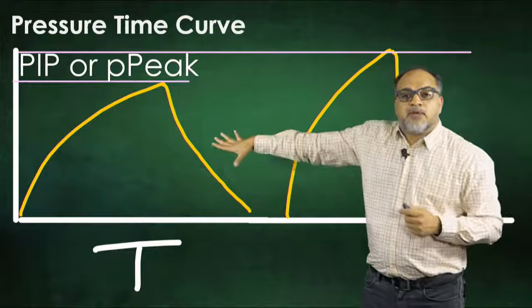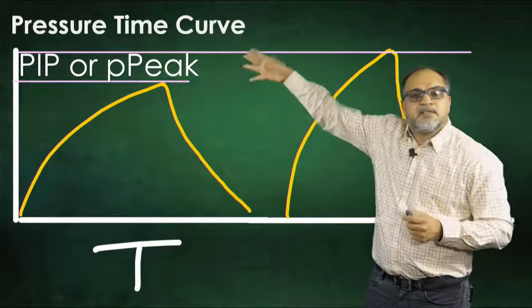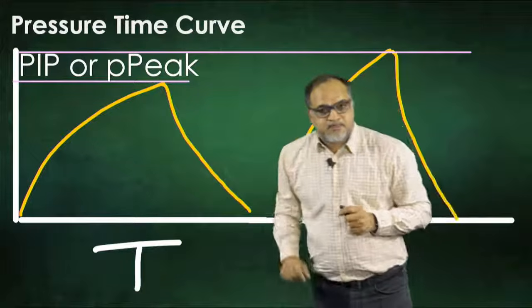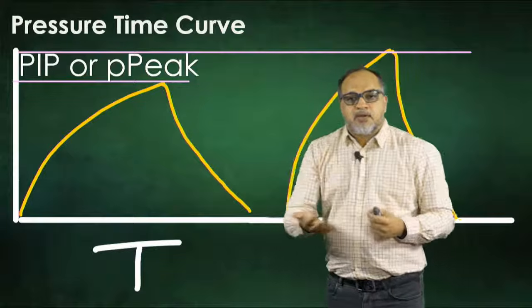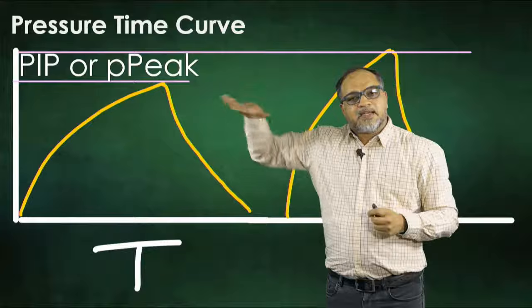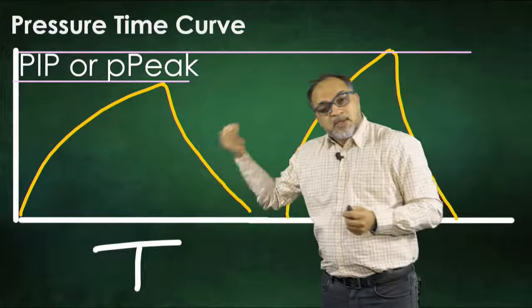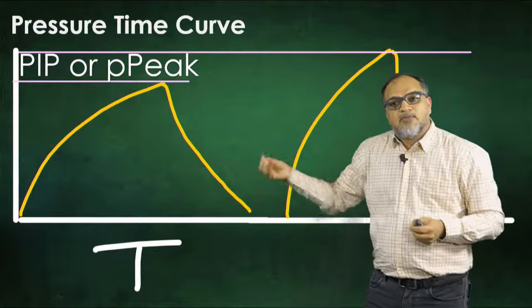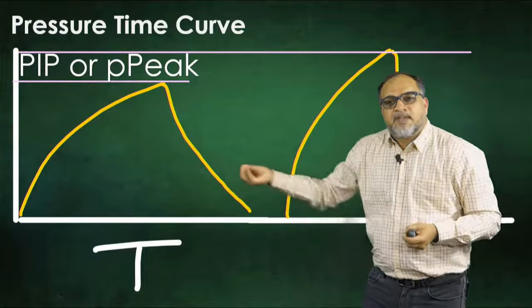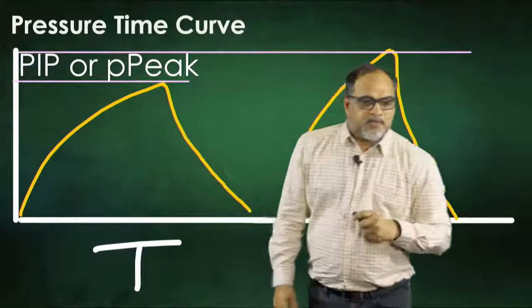This is volume control. The volume is guaranteed, but the pressure it will take to rise is not in my hands. And vice versa. If the same patient was on pressure control, I would keep the pressure target as 30. In the first scenario, it will give 500 tidal volume. In the second scenario, the pressure will not go above 30, but the tidal volume will be like 300, 350, 400, not more than that. Got it? Let's go forward.